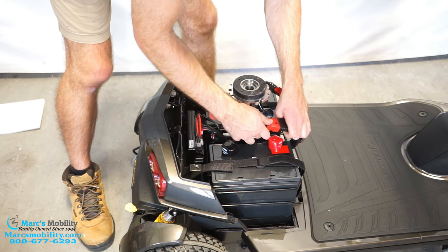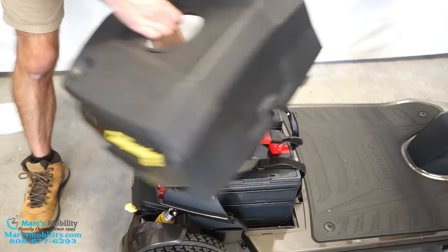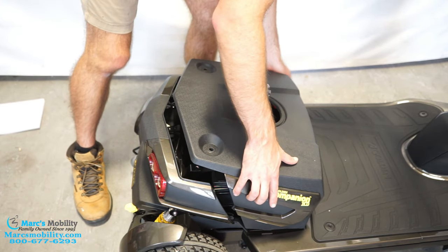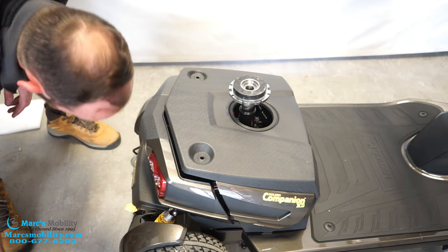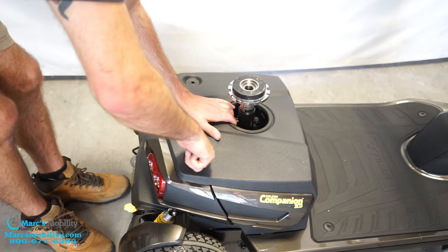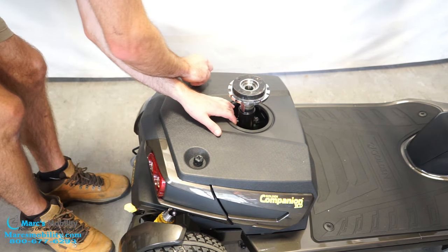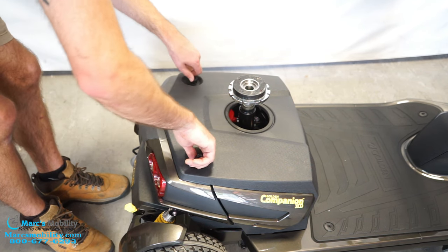Now that these batteries are plugged in, we can put our shroud back on — it just rests over there. Go ahead and get the tabs pushed down up front. Then we'll grab our two screws. You can kind of pull this back towards you until you see the threading, then we'll just screw these in.